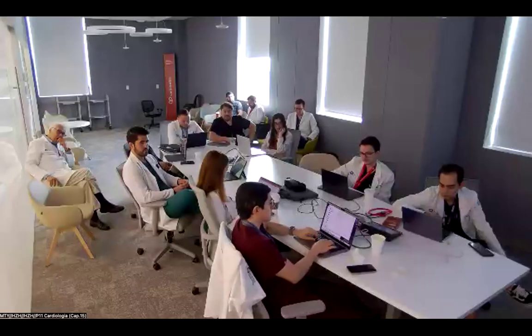And then I know in the follow-up, we have published data on this with patients who we treated with TAVI more than 5 or 8 years ago with a dilated aorta. The good news is 85% of these patients, their aorta stays static, does not further grow. That's great. 85% stays static, or even sometimes gets 1 or 2 millimeters smaller. There is, of course, 15% of patients where there is further expansion of the aorta.